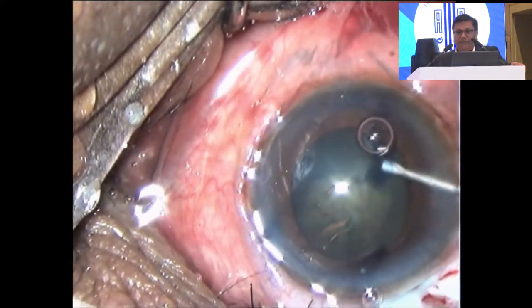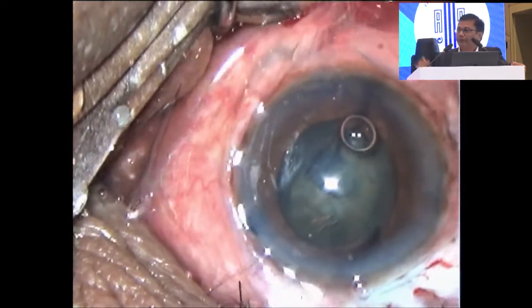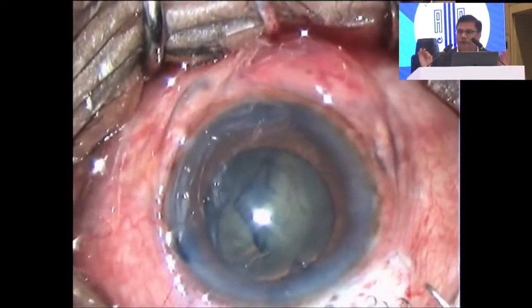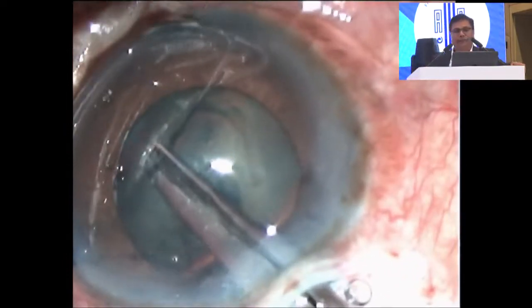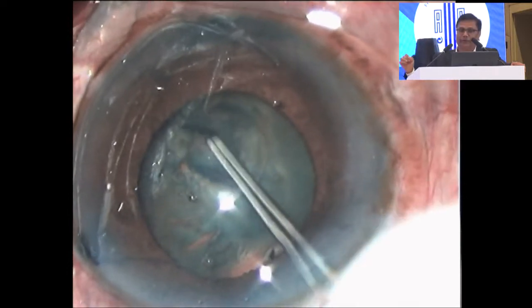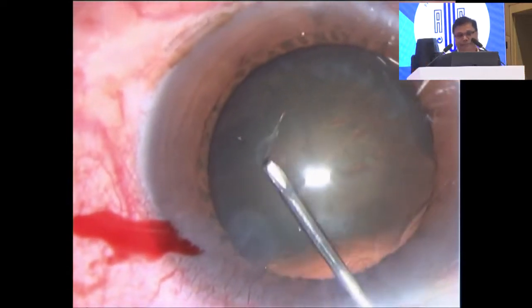Now you have to see a simple air bubble. One small tiny air bubble, and the capsulorhexis runs away. So for preparation of the capsulorhexis, the anterior chamber should be 100% devoid of any air bubble. You should have clear-cut visualization. These are some of the instruments which we used 10 years before, the Vannas scissors; still these are important. Now if you have the micro rhexis forceps and micro scissors, that is the best.